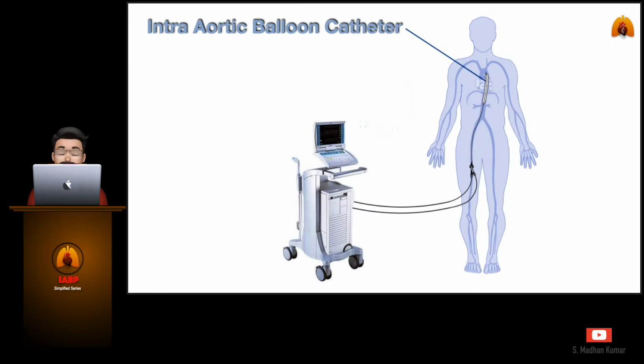Intra-aortic counterpulsation is the most commonly used circulatory assist device today. The balloon consists of a polyurethane membrane on a vascular catheter that is positioned in the distal thoracic aorta. The catheter is connected to a pump console which monitors the patient's heart rhythm and arterial blood pressure. The intra-aortic balloon is timed to inflate and deflate in synchrony with the cardiac cycle. This counterpulsation increases myocardial oxygen supply and decreases myocardial oxygen demand of the heart.